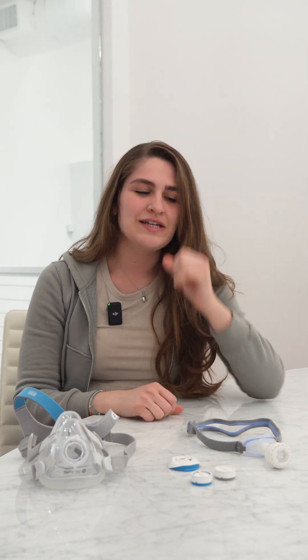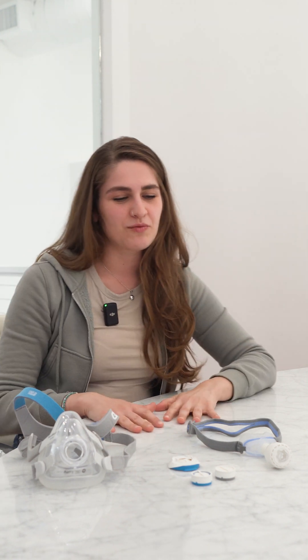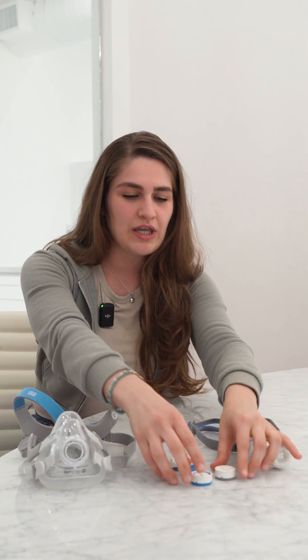Hey everybody, this is Narina, respiratory therapist at Lofta. Today we're going to be discussing one of the most exciting things in CPAP — the humidification cartridges made by ResMed for the AirMini travel device, better known as Humidex.